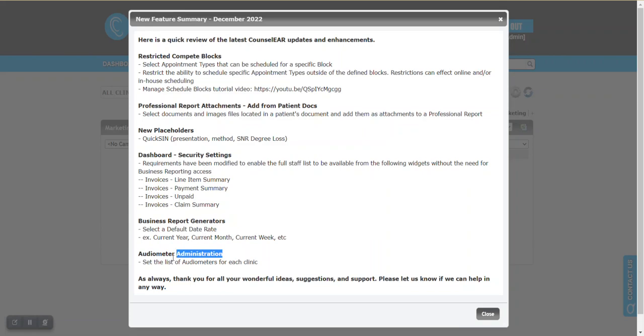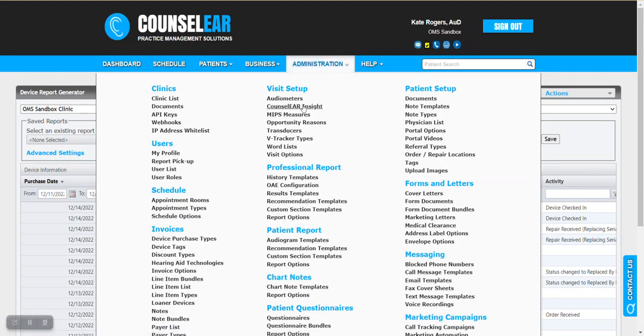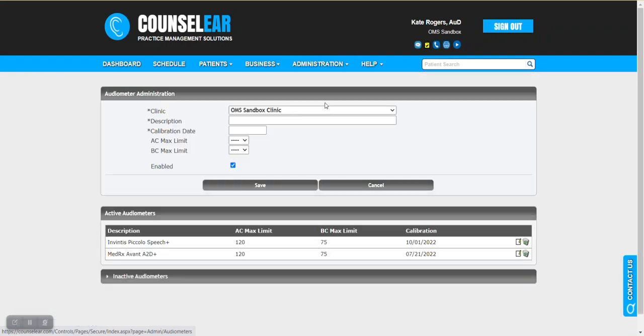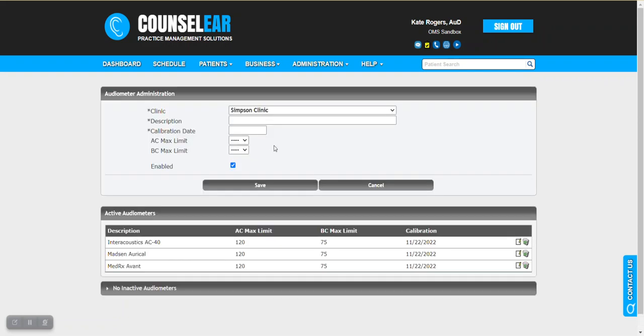And then the last thing on the list here, audiometer administration. So with this new feature, you can define audiometers on a clinic by clinic basis. So if you look at the audiometer administration screen here, we can see there are two devices in place. If we jump to the Simpson clinic, there are three devices in place. So you can maintain your device lists, your audiometer device lists per clinic.